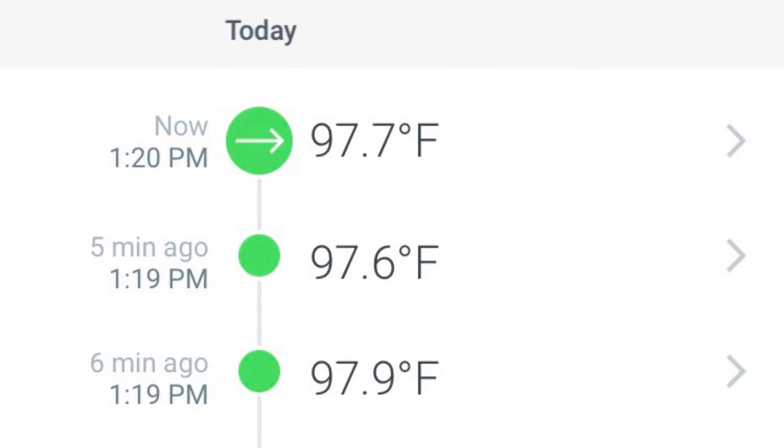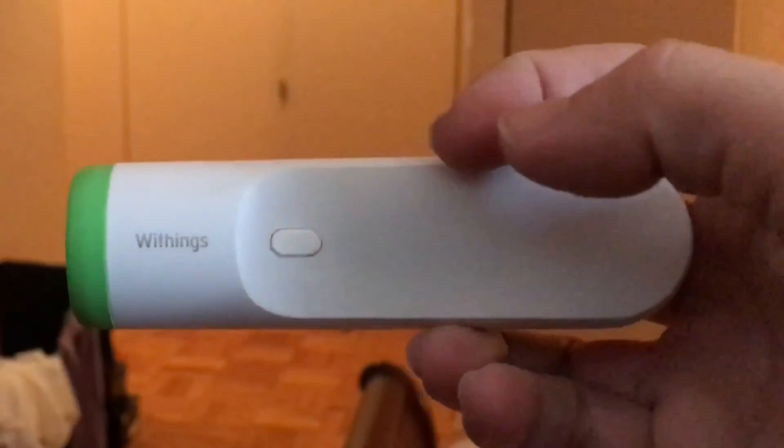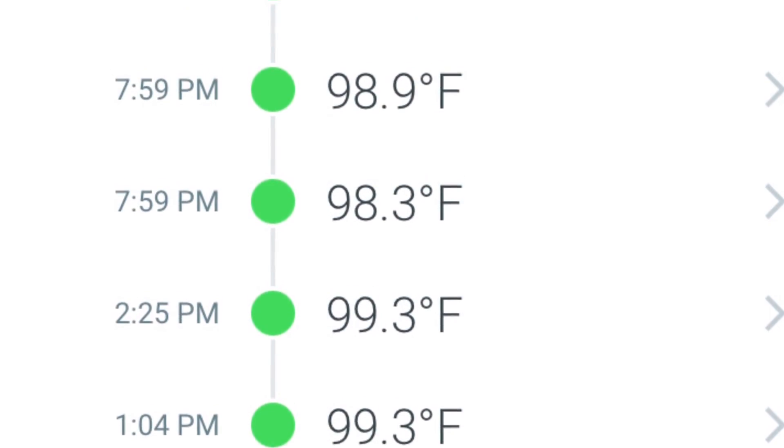Here's what it looks like in the Thermo app. I'm demonstrating on my daughter — you just swipe it across her head and you get the temperature. It's very easy to do. Shortly after I bought it, my son actually had a fever for a number of days, and it was very easy to take his temperature while he was sleeping. I would just swipe it over his head and get the temperature.